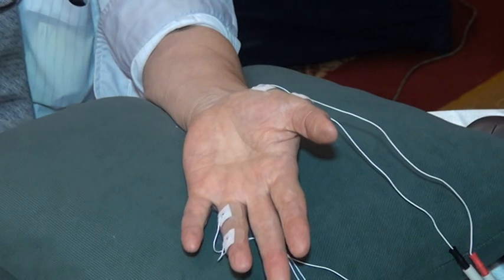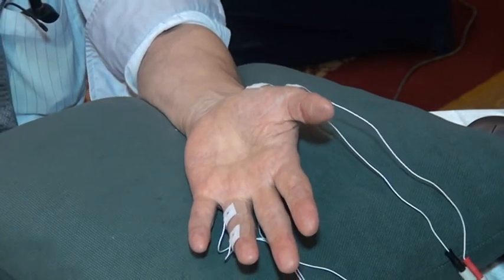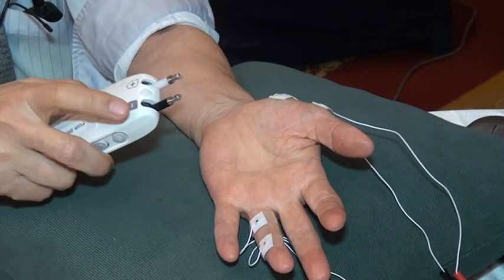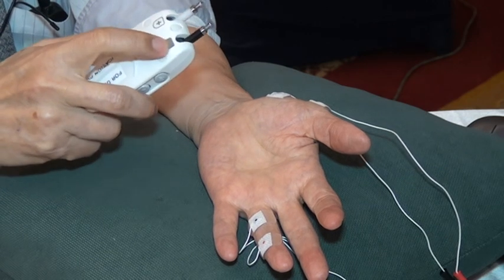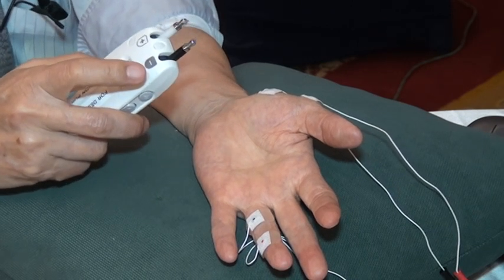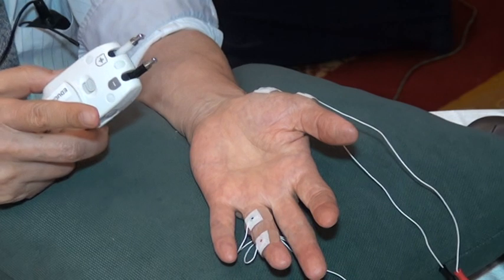Now again, if you have any questions, raise your hands and we'll discuss it. So this is how we do it. Now, the stimulating electrode again has two probes, 1 and 2. Negative here, if you can see it, this negative is the cathode. Remember cathode from cation, because this attracts cation, it's a negative pole, which is the stimulating pole.